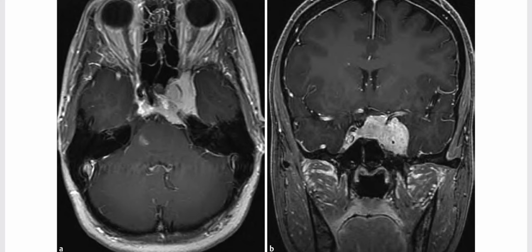There is also extension of this mass into the prepontine cistern on the left side. The hyperintense signal overlying the pons on the right side is artifactual. Considering this imaging finding, the top diagnosis is meningioma.